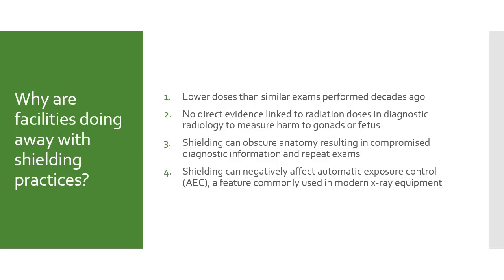Shielding may obscure anatomy, resulting in compromised diagnostic information and repeat exams, and shielding can negatively affect automatic exposure control, a feature commonly used in modern X-ray equipment.